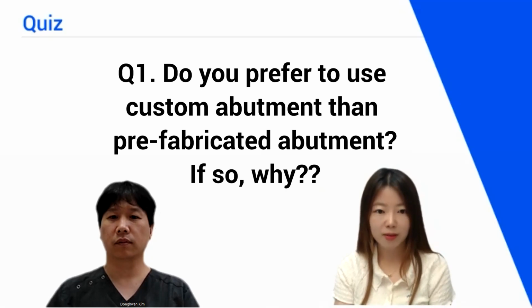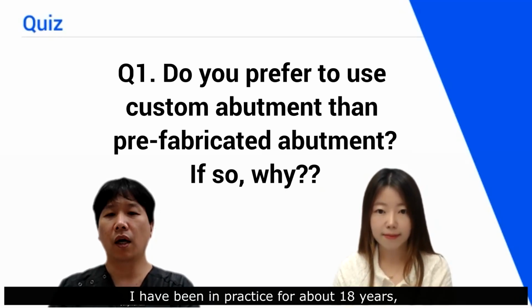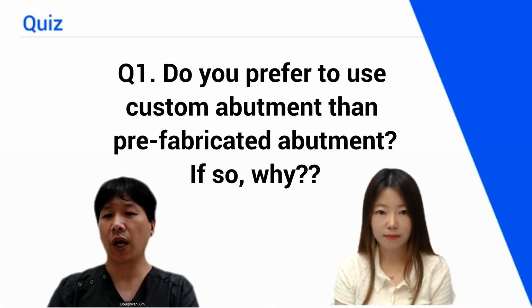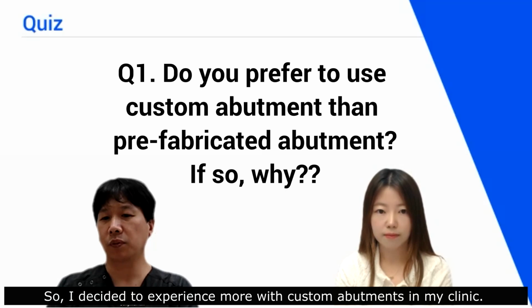Question number 1. Do you prefer to use custom abutment than prefabricated abutment? If so, why? I have been in practice for about 18 years, and for the first 15 years, I only used prefabricated abutment. However, for the past 3 years or so, I have been using custom abutment only. The reason is that I received many questions about the differences between the two abutments during my lectures. So I decided to experience more with custom abutment in my clinic.